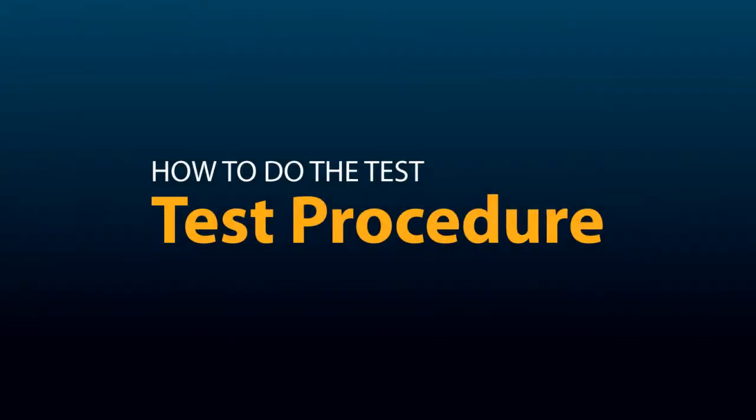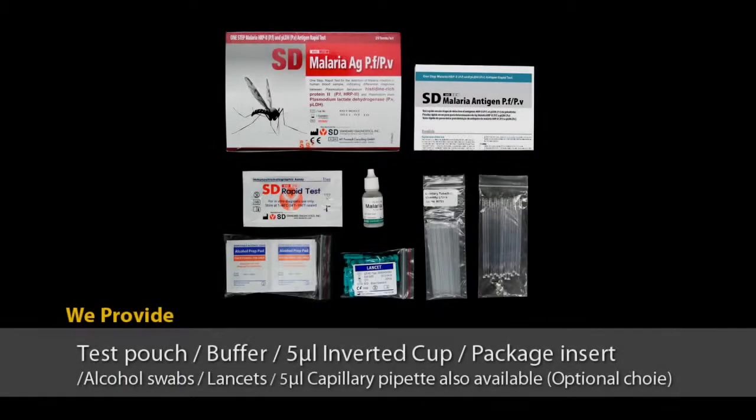SD BioLine malaria rapid test is easy to use. The materials included in the kit are test pouch, buffer, inverted cup, package insert. Alcohol swabs and lancets are optional materials. A capillary pipette is also available when required.